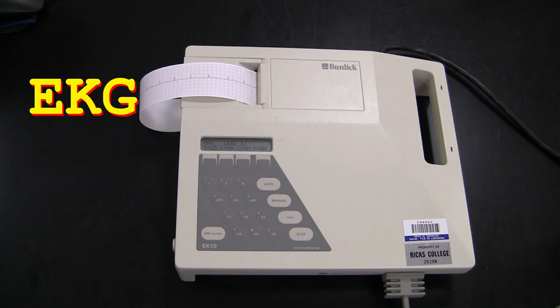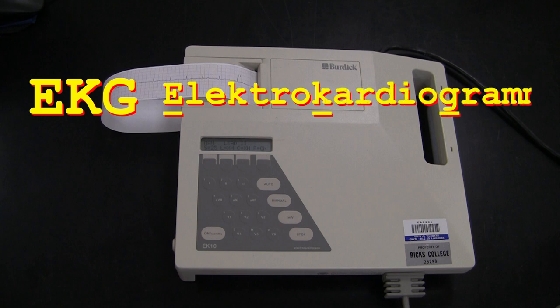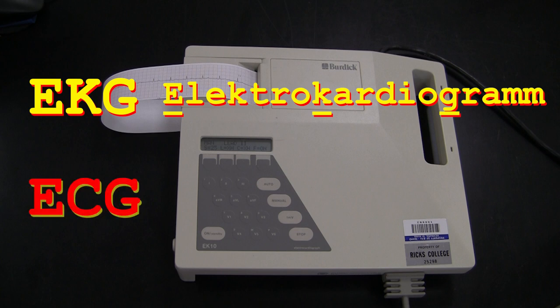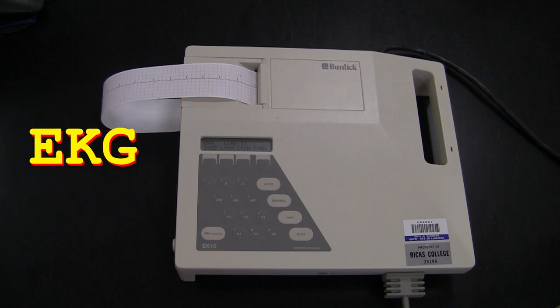Okay, so what does EKG mean? EKG stands for electrocardiogram. Well, at least it does if you speak German. You might also hear them called an ECG based on the English spelling of electrocardiogram, but EKG is a more common term. Anyway, either way you spell it, an electrocardiogram shows the spread of depolarization across the heart.